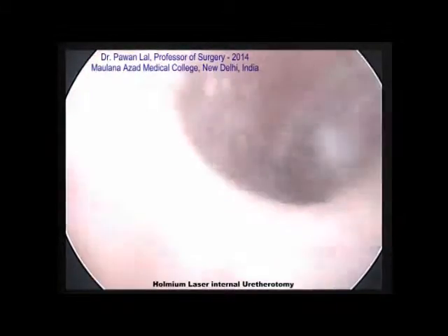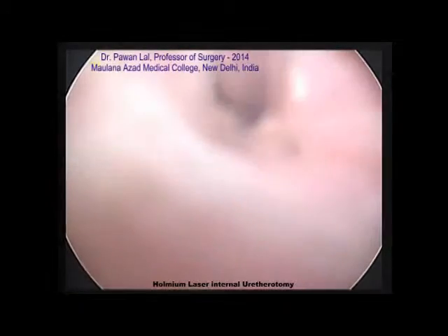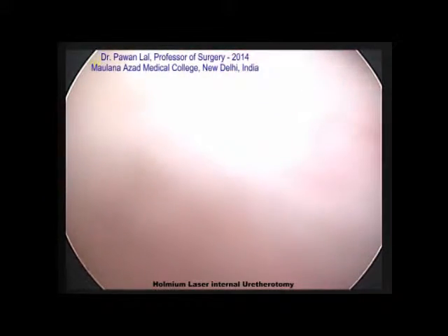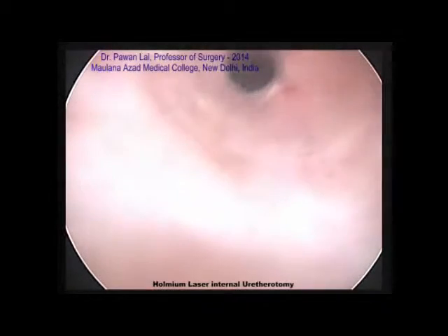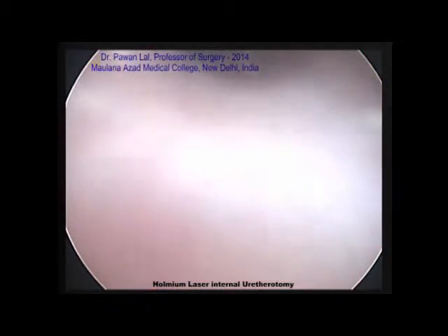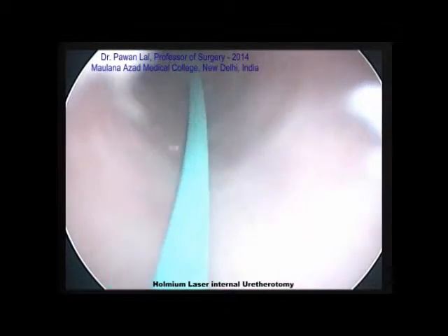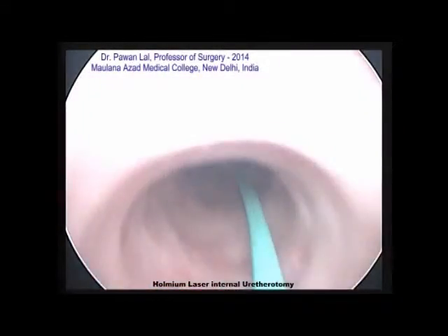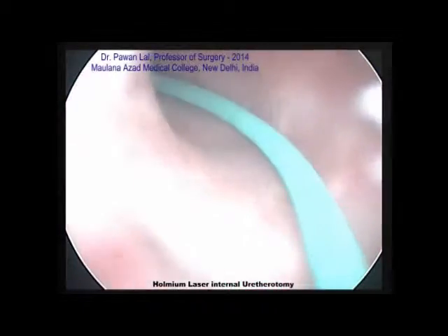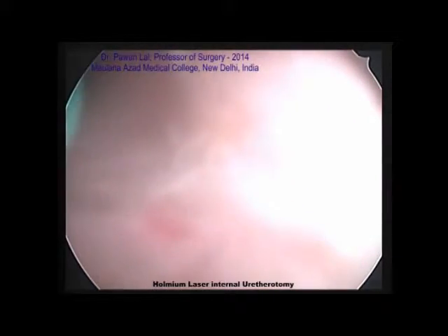In this clip I am demonstrating holmium laser internal urethrotomy. The patient presented with decreased urinary stream and straining during urination. On the patient's MCU study we found the patient had a bulbar urethral stricture. It was a short segment stricture, therefore we decided to do internal urethrotomy in this patient.